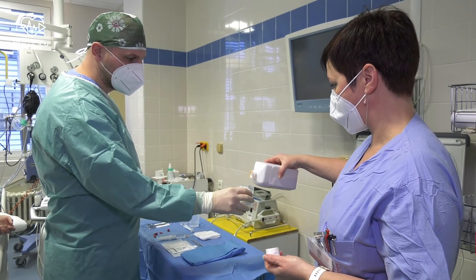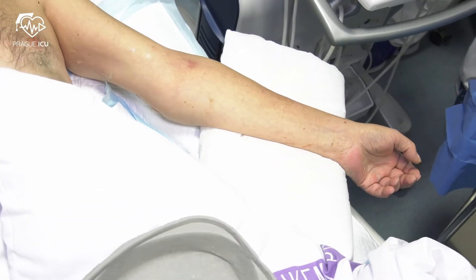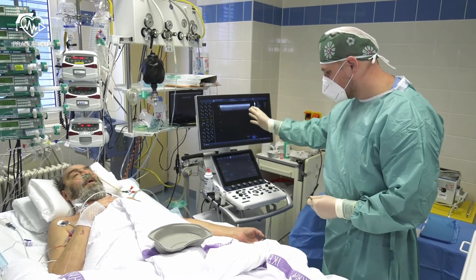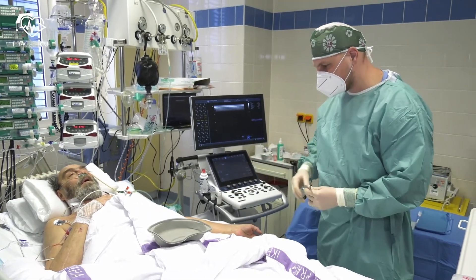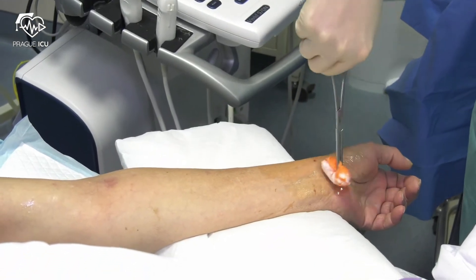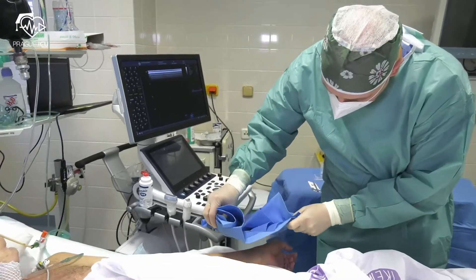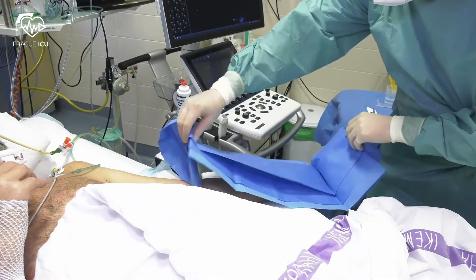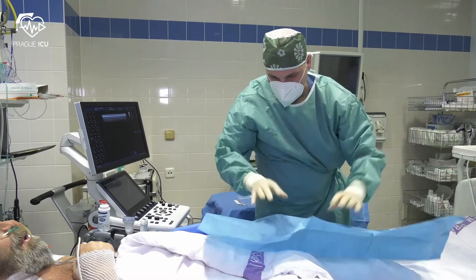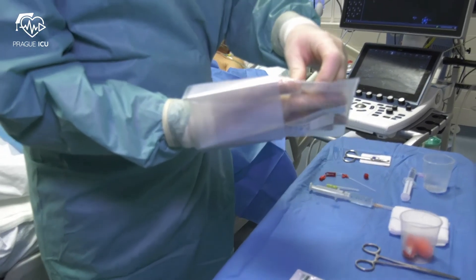Prepare chlorhexidine for sterile swabs. Position the forearm in a supine position with the wrist in mild dorsiflexion. Place the ultrasound in a straight view line on the same side as the punctured hand. Prep the forearm with chlorhexidine swabs.